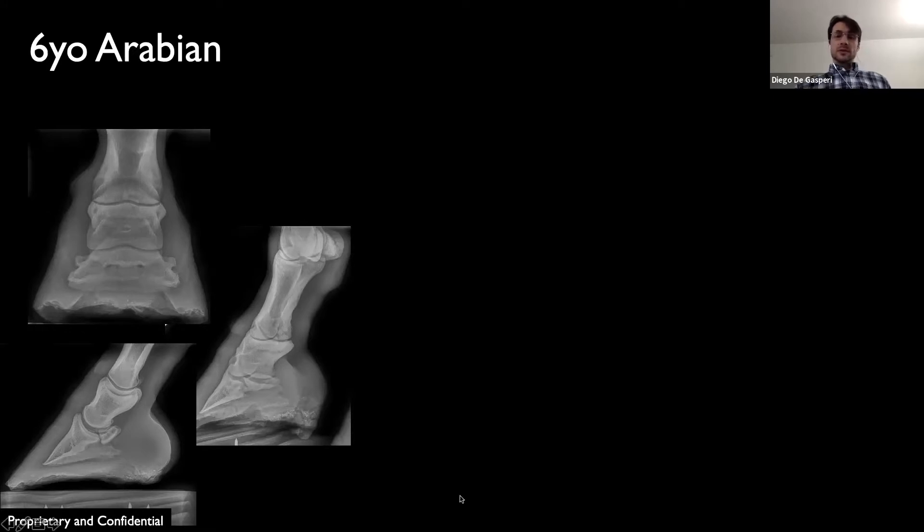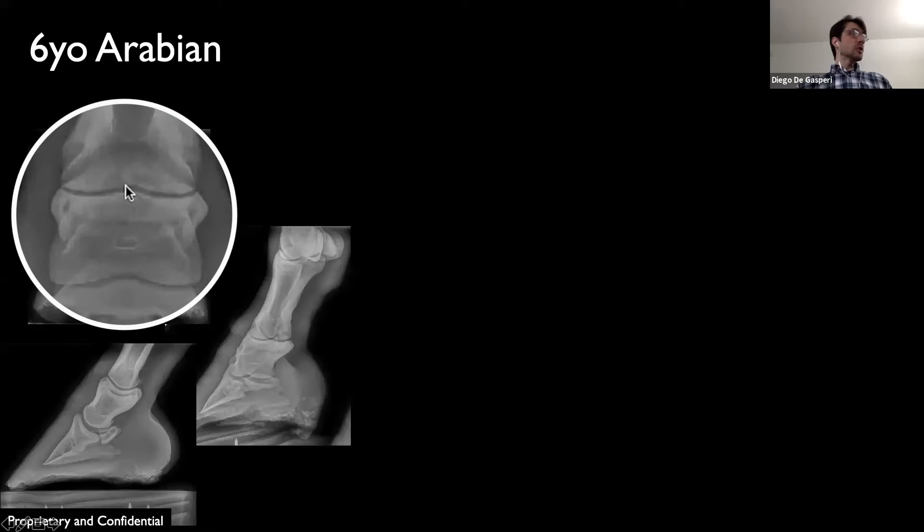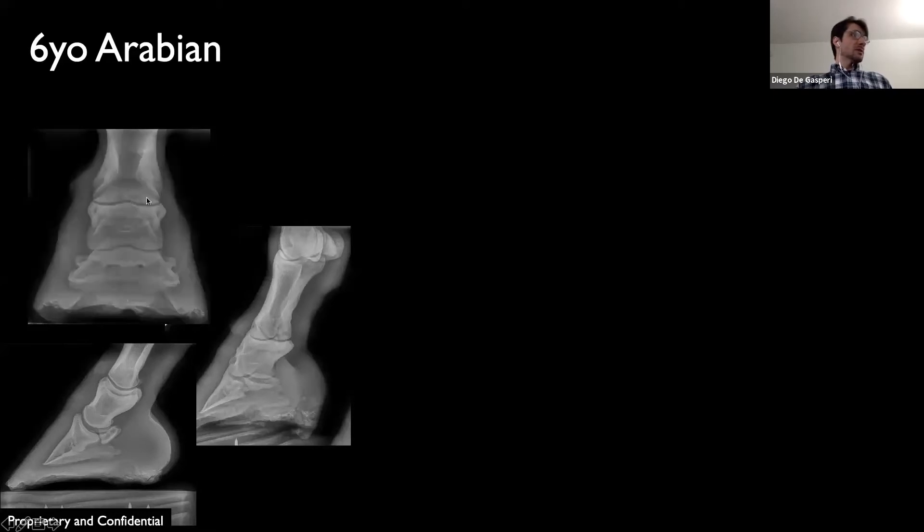Radiographs taken in the field were indicative of fragmentation in the palmar pouch of the pastern joint. I hope these images are large enough for you to see, but there's some opacities suggesting fragmentation in the palmar pouch of the pastern joints.